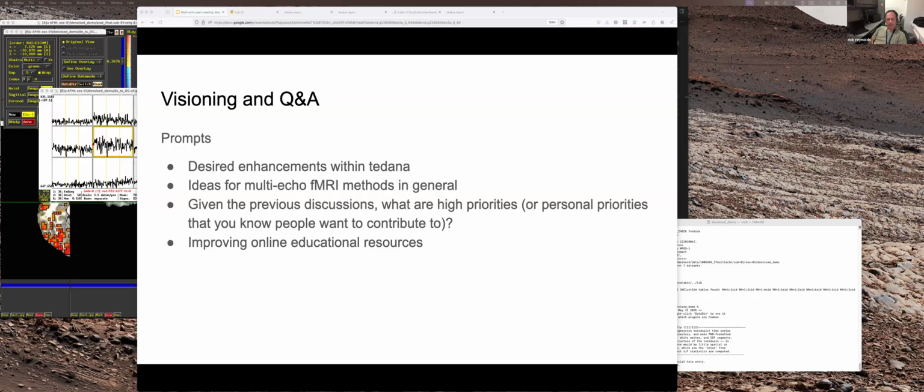The PCA is done on the OC data, is it not? If that's the case, yes, the OC data you could slightly clean before making your decisions, possibly.